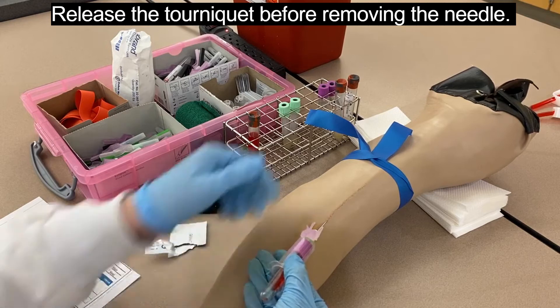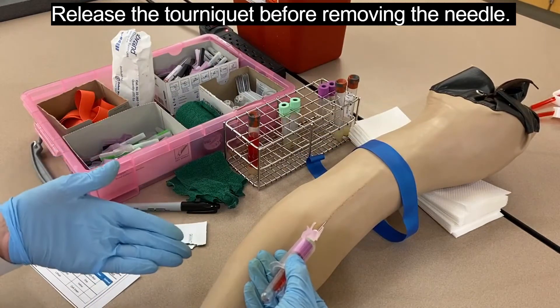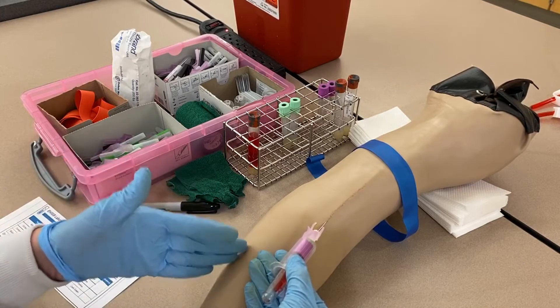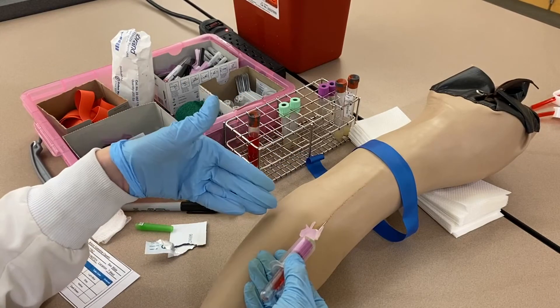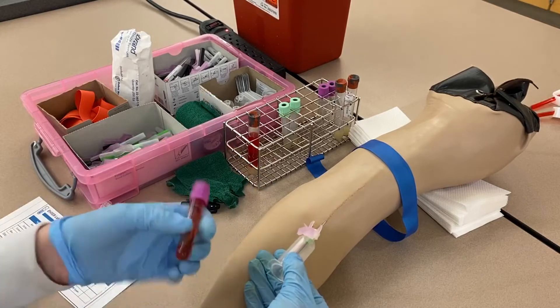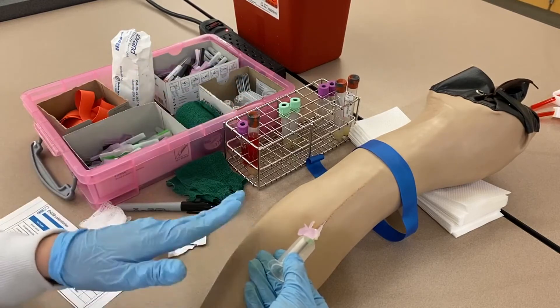I can release the tourniquet now — I could have released it while the first tube was filling; I just forgot. It's better to release during the first tube fill, especially if you're new to changing tubes, because sometimes when changing tubes the needle can pop out. If the tourniquet is still on, blood can start bubbling out of the open wound, which is disconcerting for both the phlebotomist and the patient. Invert the tube to mix the blood with the anticoagulant.